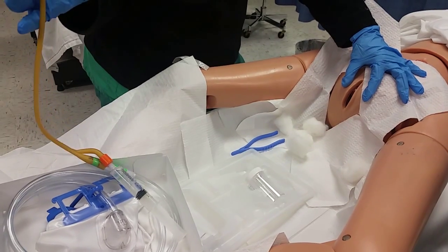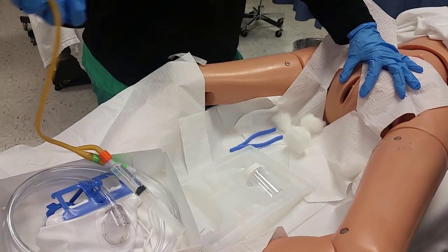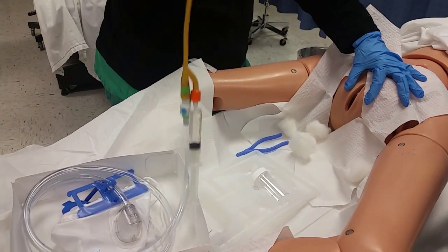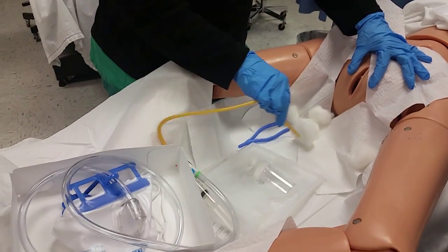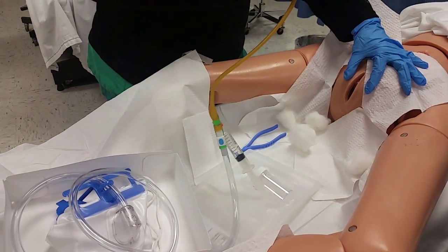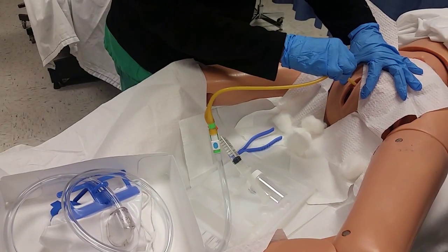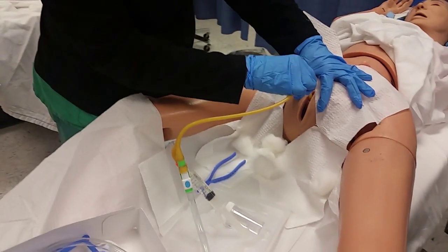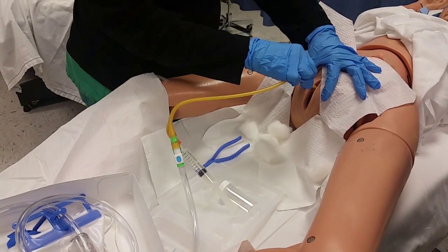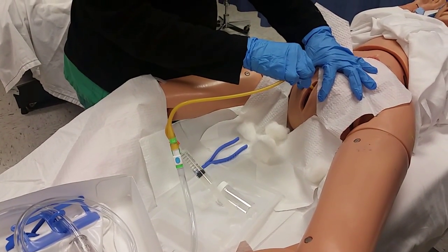Do not dip it so much that you see the opening gets clogged. On smaller Foleys, it would be easier to clog, opposed to a larger one. So we've dipped it. Is all of this still sterile? Yes — so if I even drag this, that's sterile. That's the key. So when you go in, you keep going until you see urine — the golden river.